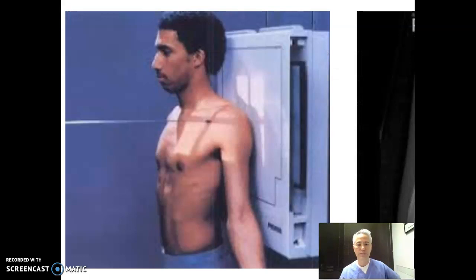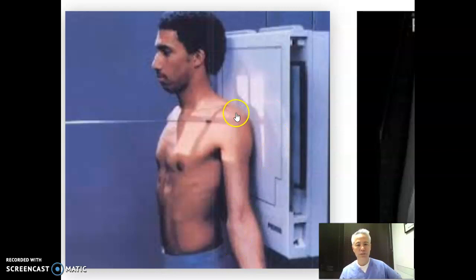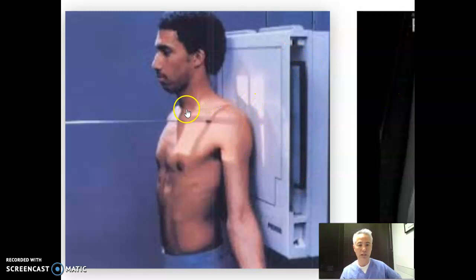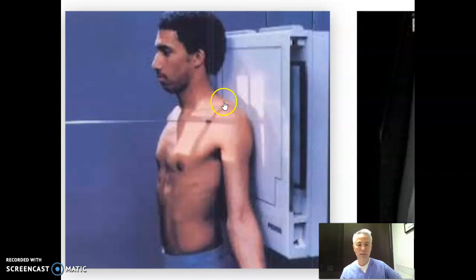This is our AP view of the shoulder with external rotation. What's good about this is that the patient's back is flat against there. There are a few things that are terrible though. The amount of light field above here is not good — it looks like a 10 by 12 vertical image, which it shouldn't be. This should be a transverse cassette. Notice that his entire clavicle is not on there, so we need to get all the way from the mid-sagittal plane to the outside. The outside line is good, but the inside line is terrible. The top line is also bad — this needs to be low enough so that we get the inferior edge of the scapula on there, which sits at about T7.